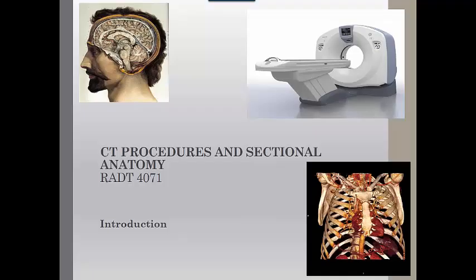And if you're taking this course locally and will be utilizing the ULM clinical affiliates, then you'll have the chance to work on just about all of these machines. But as I said, regardless of the brand of scanner, the positioning and the images are still consistent. The protocols and software packages within the CT system are what vary the most.